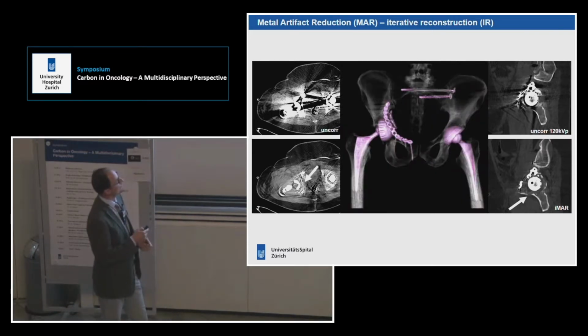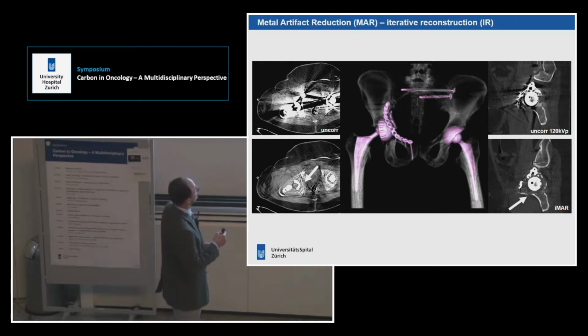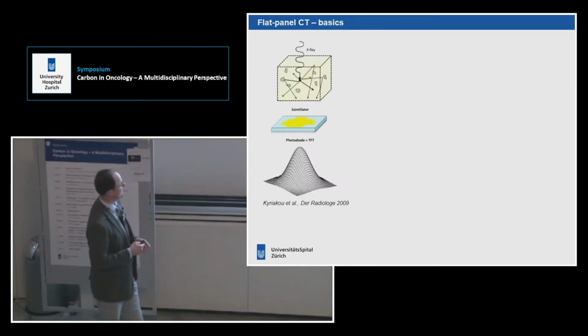And we can also produce those volume-rendered tomography images devoid of any artifacts, which nicely show the delineation of the implants and the surrounding bone.